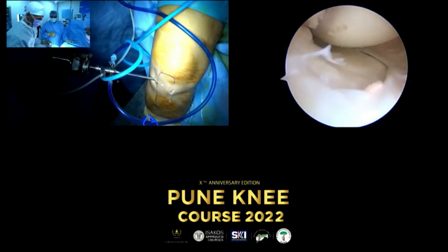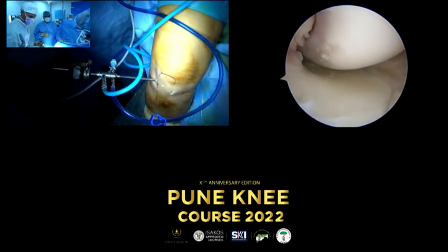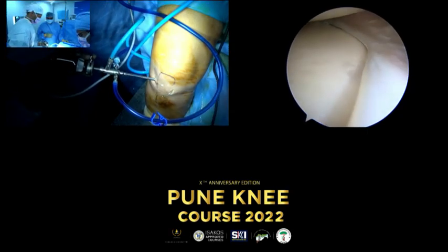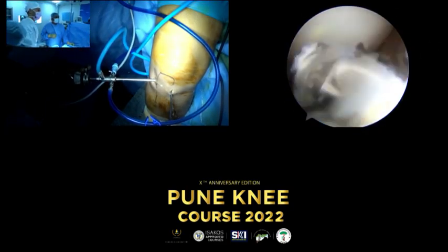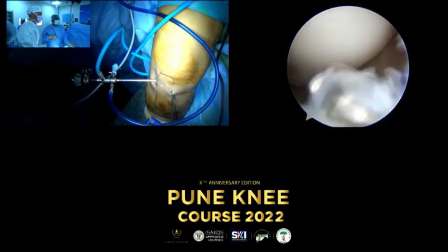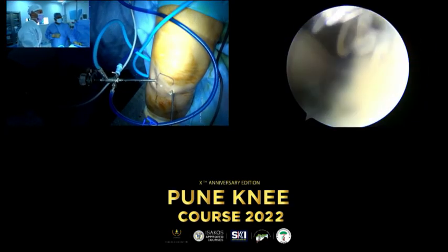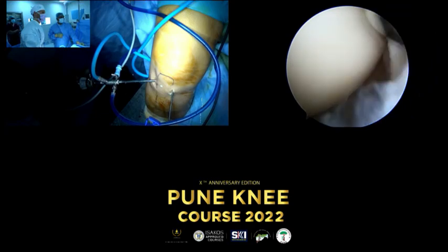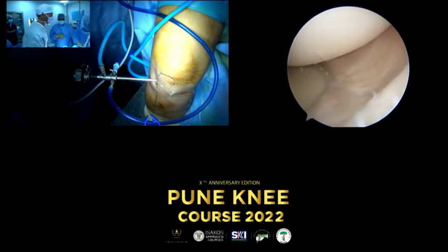Yes. Okay, so I open it up a little bit, and another tip I recommend, probably not here because it's a revision case, so the soft tissue is already kind of fibrotic, but in primary cases, I recommend also sealing the edges of the portal with the radiofrequency to decrease the risk of problems with the sutures. I open it generously, so this will prevent any potential headache later on. As you are seeing here, I think it is big enough. Now we go with the radiofrequency, as I commented before.